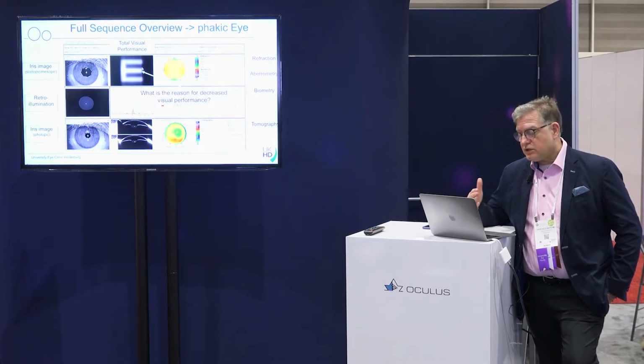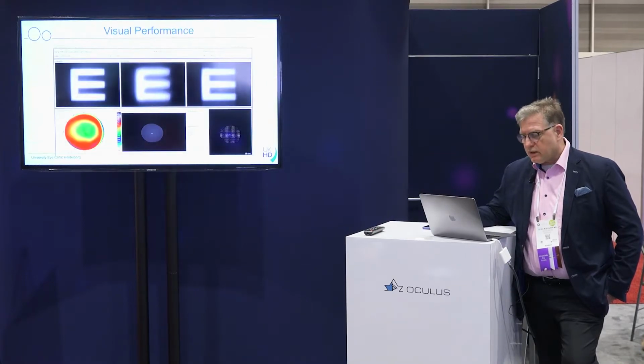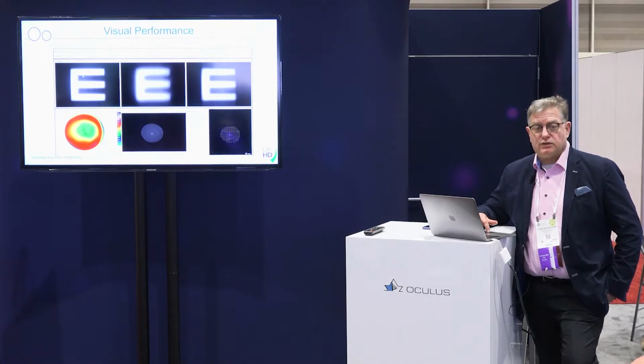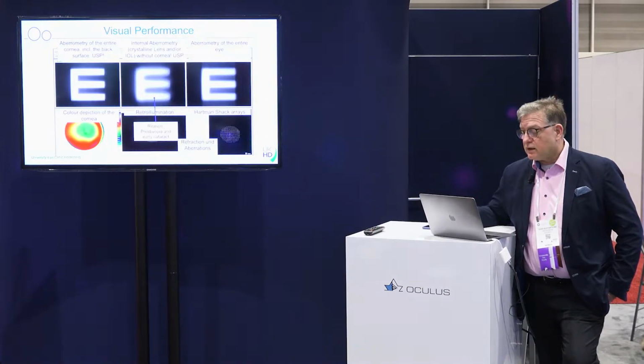Yeah. So the machine can look at the corneal plane and at the lens plane. Here, for example, you see this is the cornea, and the vision quality is quite good, so there is no corneal aberration here. The problem here is the lens. The total performance is compensating a little bit of it, but it is therefore somewhat fuzzy. And the reason, if you look at this very clearly, is a kind of presbyopia and early cataract, which causes this problem, and you can define that.